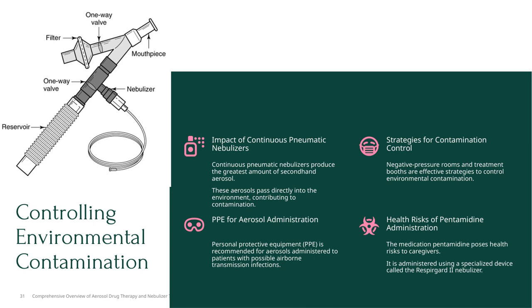When administering medications like pentamidine, it's important to recognize the health risks involved for caregivers. Pentamidine is administered using a specialized device called the RespirGuard II nebulizer, and handling it requires extra caution due to its potential health hazards. This brings us to the importance of personal protective equipment, or PPE.